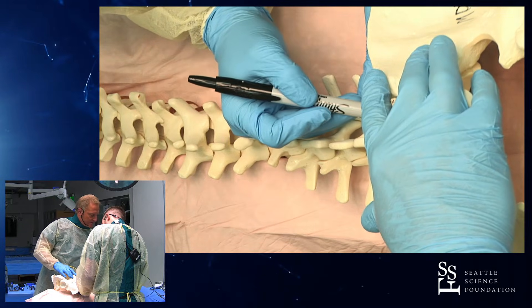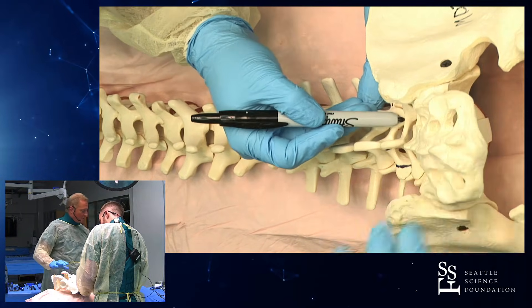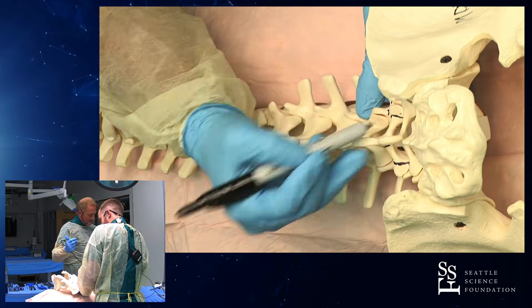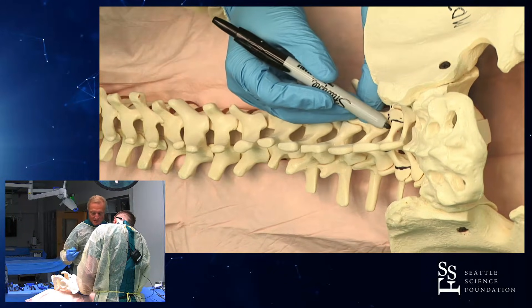To make a nice U. The U should be high enough so that you can go above the ligamentum flavum and you automatically have the ligamentum flavum disinserted.